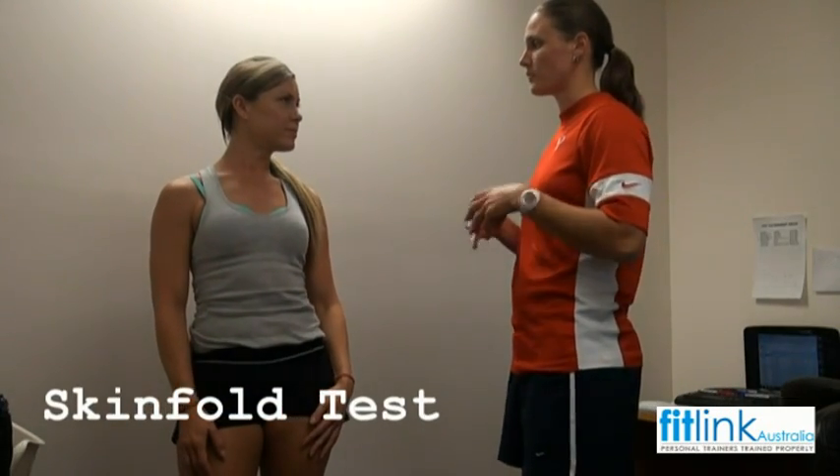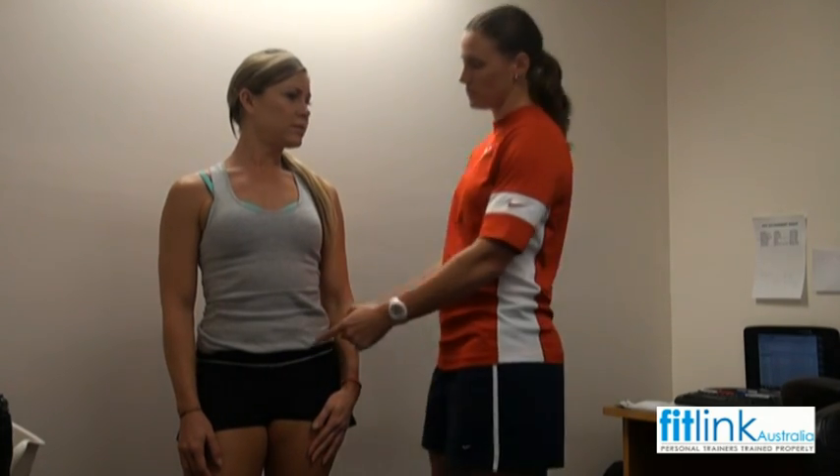Okay Sha, so what I'm going to do now is a skinfold test. This is actually going to be a test of your body composition, giving me a percentage of body fat. I'm going to take it from four sites: one from your bicep, tricep, your subscapular, and your super iliac.